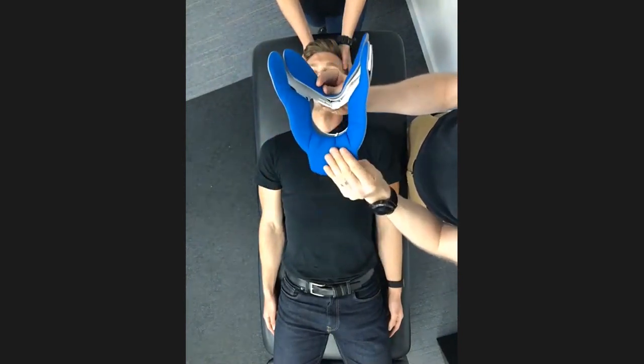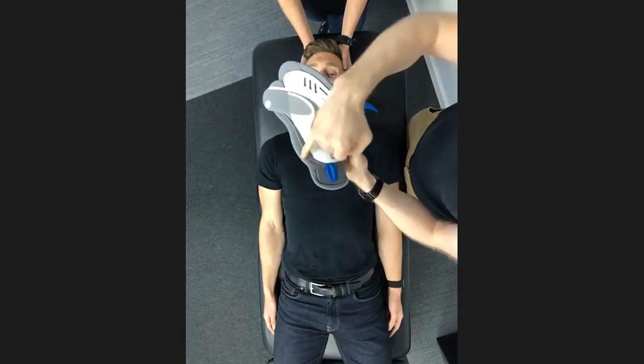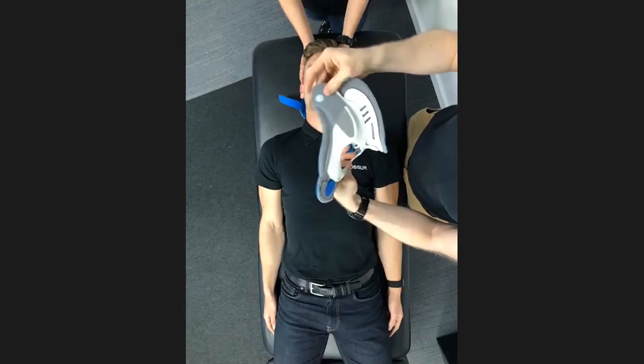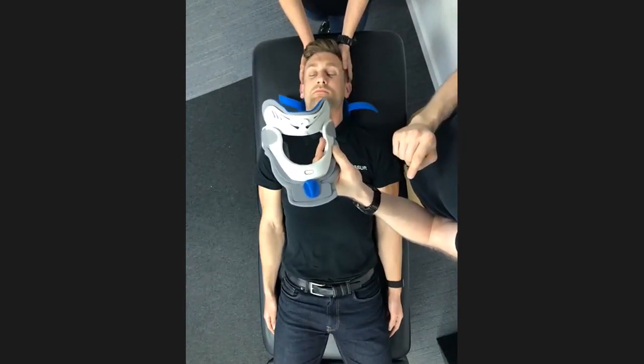So I'm just going to place the padding back into position. Whenever you adjust the padding, it's really important that we make sure that the edge of the padding is visible all the way around the collar. None of the plastic sections should ever come in direct contact with the patient.